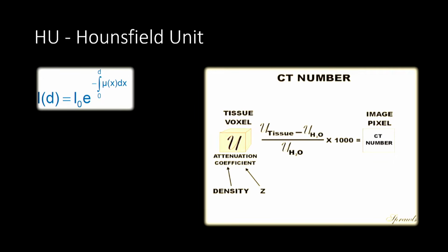If I go and get a CT here in Houston, and then if I go somewhere in Taiwan and get a CT, the value that we are measuring in our, say, liver, for example, even in a non-contrast scan, has to match across vendors, across time points. And that can only happen because, just like we normalize in photography to maybe a sky pixel or a black pixel, we normalize.